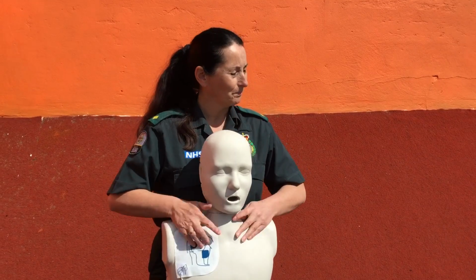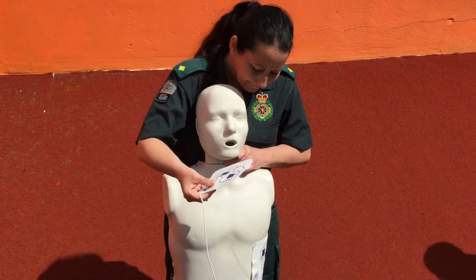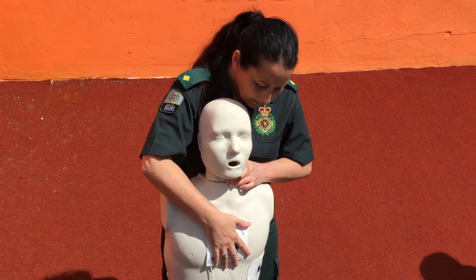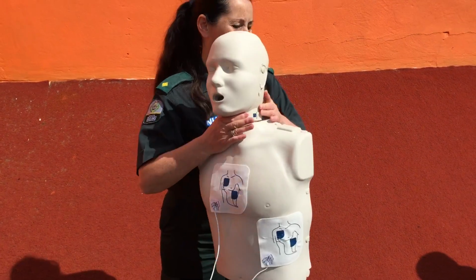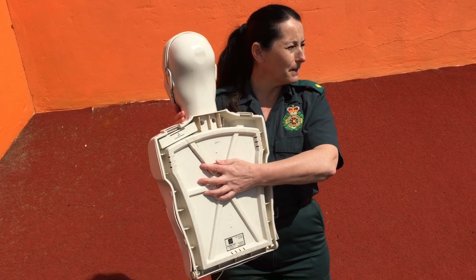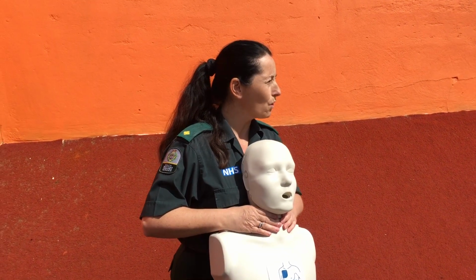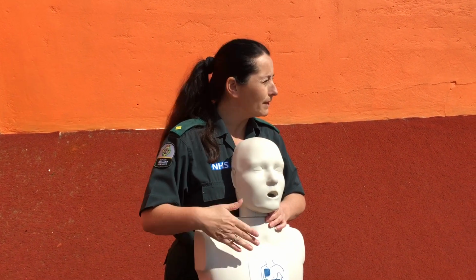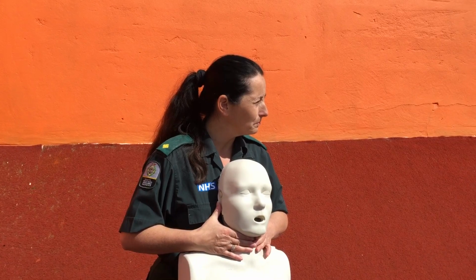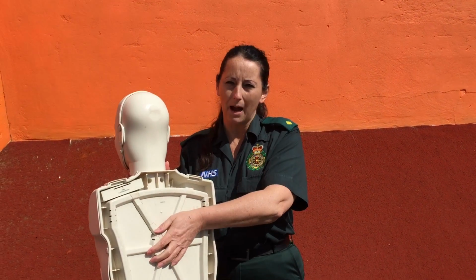So one would be on the front, and then one would be on the back. Because children's bodies are a lot smaller than ours, their organs are a lot closer together, so the shock isn't going to be as effective through the heart. So that's why one goes on the front, one on the back.